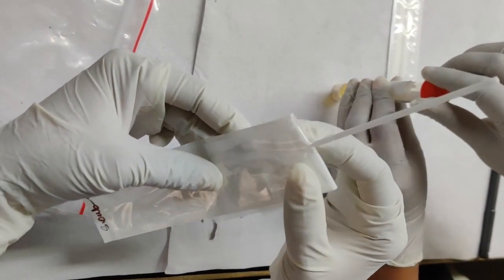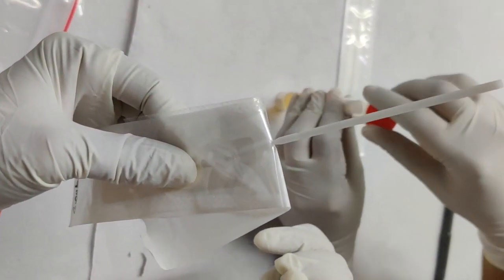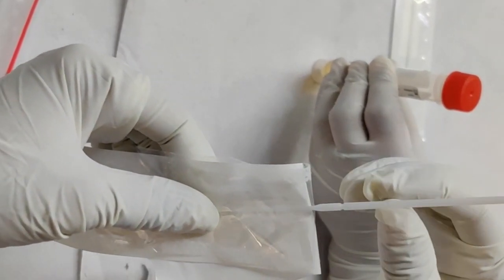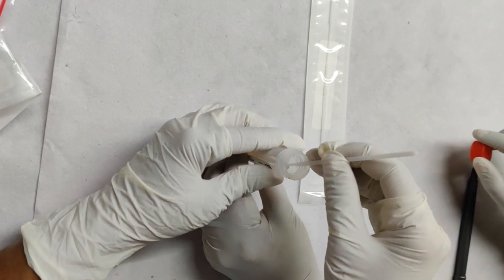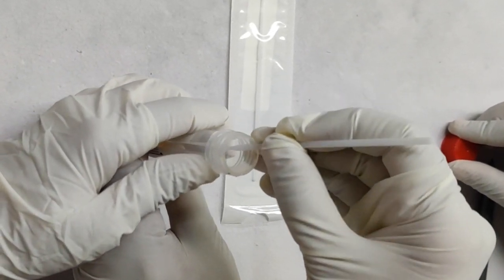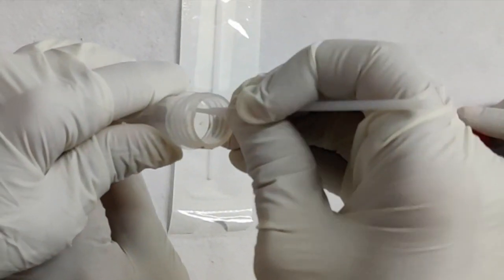At the middle of the swab, there is a line which is the point where you break the swab once you have collected the sample and you are transferring it into viral transport medium. It has to be transported like this, that is after collection. Then the swab has to be broken with applying a force on the area at the midline of the swab.